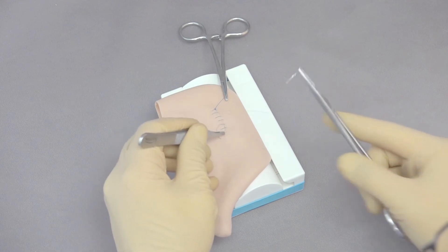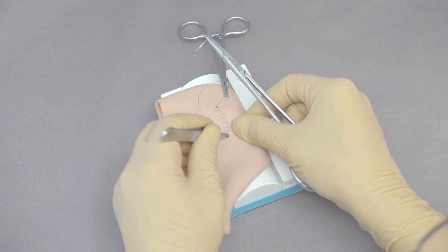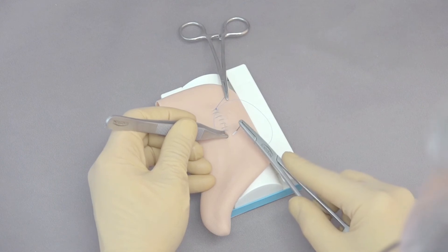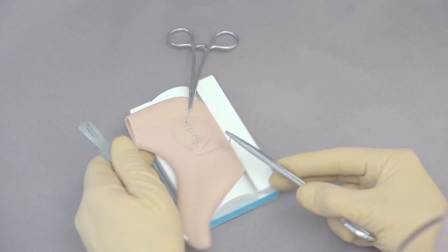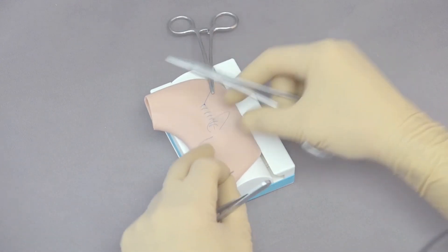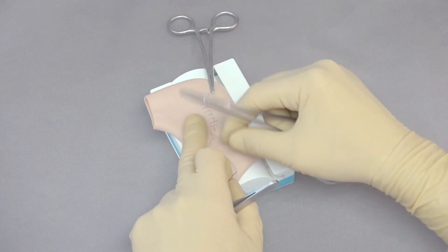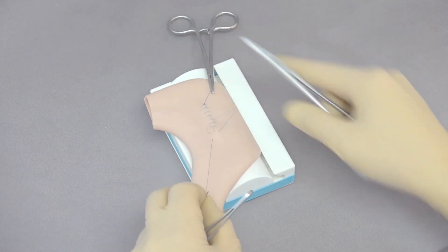This last one you can see is a little more challenging because I'm at the end of the incision, so what I want to do is come back, use the thumb forceps, and come just past the incision in order to secure that. Now, it's a simple continuous line closure. I'm going to make sure that I've done a nice job tensioning my sutures as I go.